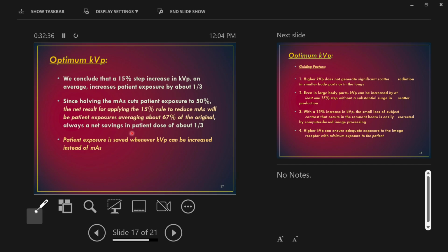You have to keep in mind the one important thing. What is kVp control? Penetration, and how does it control grayscale? Or does kVp control grayscale? Yes. Yeah, right? So by changing the kVp, you're affecting all these things, receptor exposure, patient exposure, and it sounds good, but if you change it too much, you end up affecting contrast, okay?